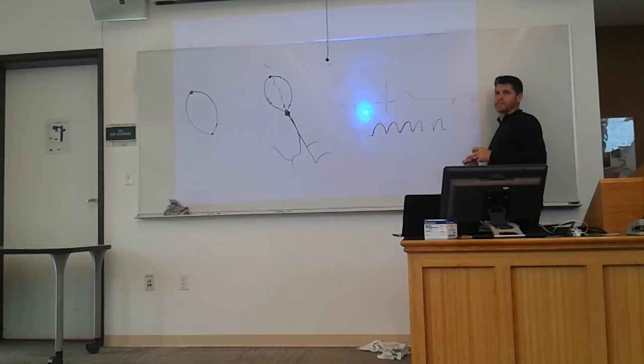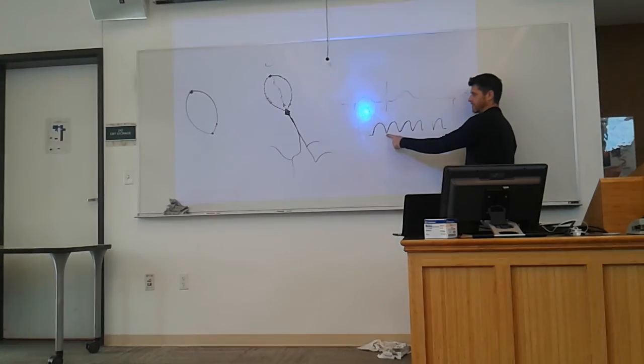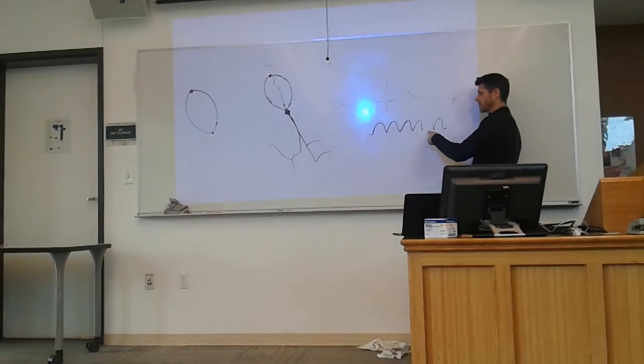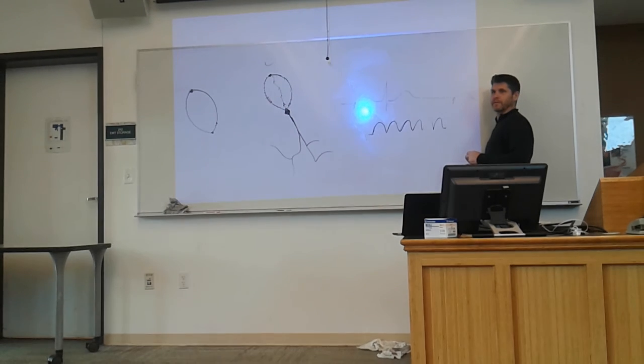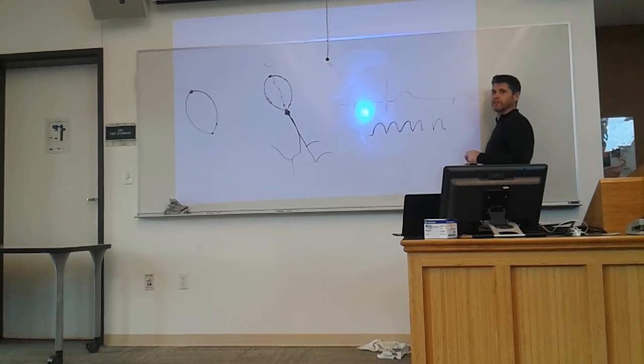If the majority of the cells being depolarized on the second P wave are going away from the camera, how is it a positive deflection? It won't necessarily be positive. I didn't necessarily draw a positive deflection here. We can't tell where the baseline is. It can certainly be where the deflection is, and most commonly is. Okay, I think that makes sense. So what you're seeing is potentially the downward deflection, not absolutely the upward. Well, then why is it so peaked?